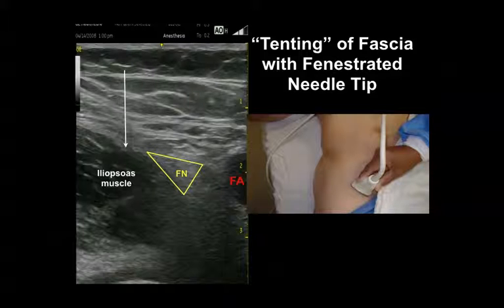If we look at where our insertion point would be lateral to the femoral nerve, we can see that a safe place to advance the needle would be in the lateral third of this image. If we use the corresponding site on the ultrasound transducer, specifically the lateral third of the transducer, this will allow us to advance our needle in a position that will not endanger the femoral nerve.